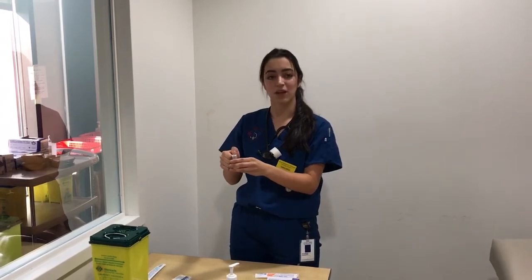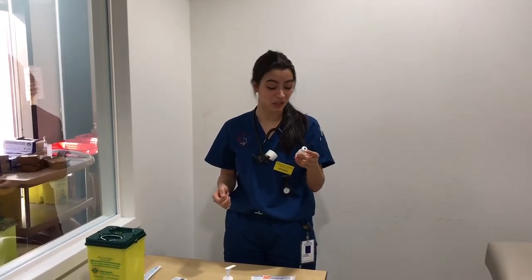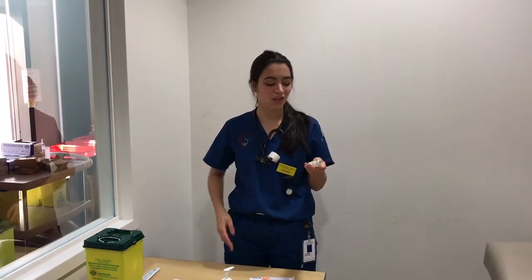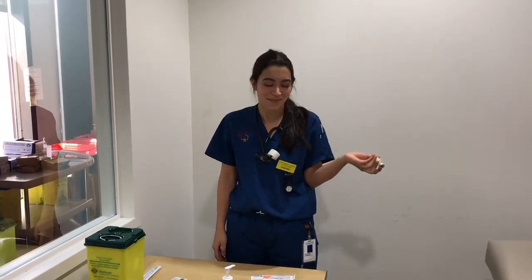Typically there would be a cap that you'd have to pop off to make sure that it hasn't been used before, because this is a single-use vial, so it means it would have to get discarded after we used it, but for instructional purposes we're not going to do that. It's also important that you make sure that you have medication that isn't expired. In this case it is expired, but it's okay. We're going to do it for educational purposes.